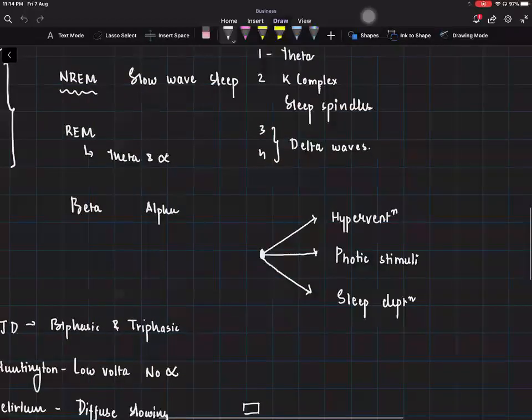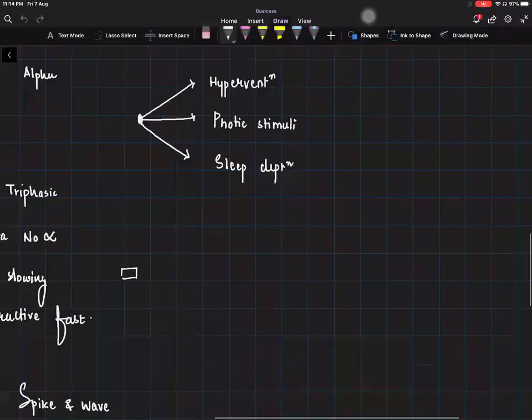Just to make this rather boring topic interesting, what is an MEG and how does it differ from an EEG? Anyone? Magnetoencephalogram. And how does it differ from an EEG? I am guessing that there we are measuring electrical waves and here obviously not.